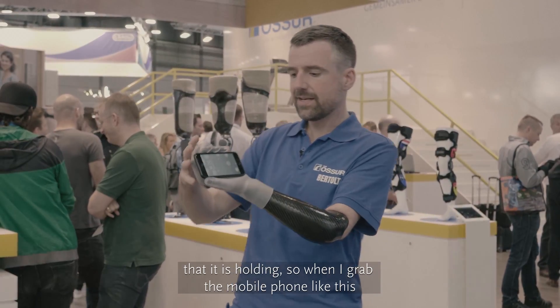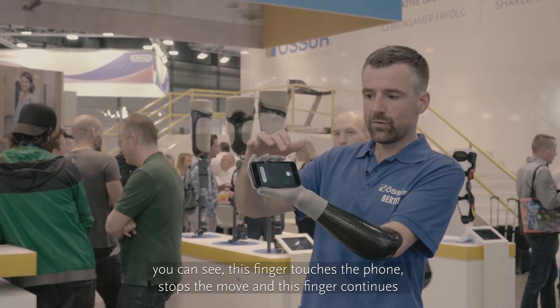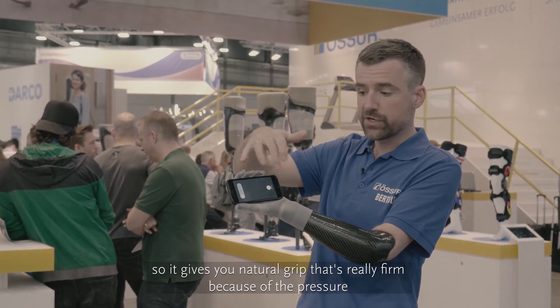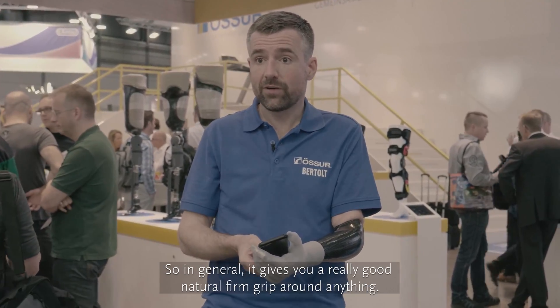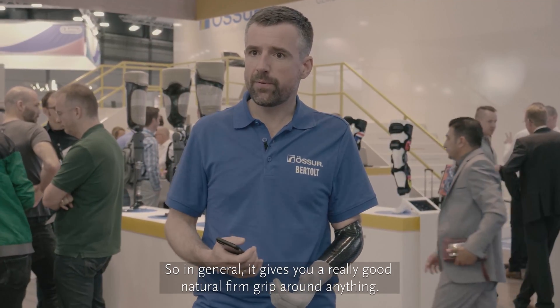So when I grab the mobile phone like this, you can see this finger touches the phone, stops moving, and this finger continues. It gives a really natural grip that's really firm because the pressure is distributed evenly — and this is how you're supposed to hold a mobile phone. In general, it gives you a really good, natural, firm grip around anything.